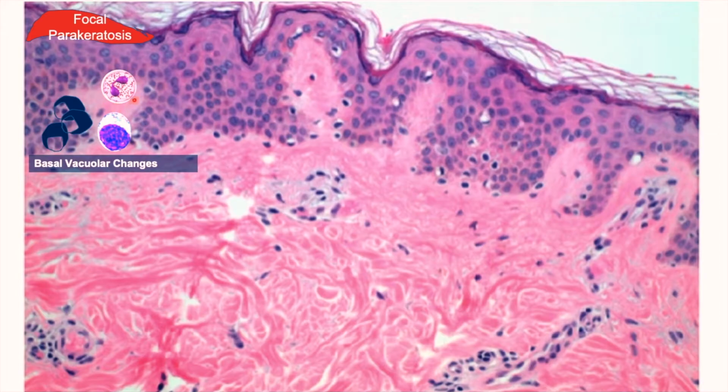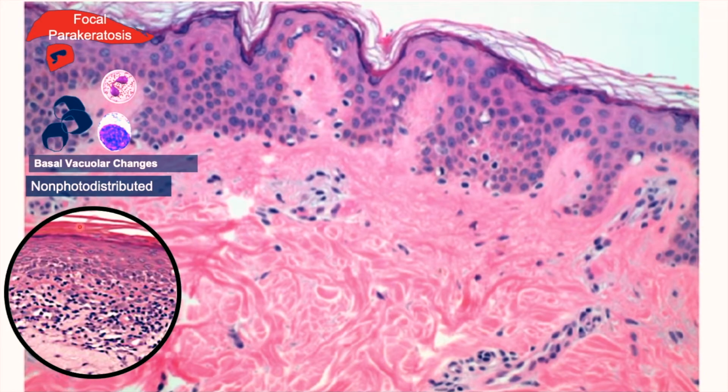We see eosinophils, which is a hallmark for medication-related dermatoses, with some plasma cells in non-photodistributed areas, and we see the dyskeratotic cells now start to appear above the basal cell layer. Like this example, this is lichenoid drug eruption, which is the mildest form of those drug-related lichenoid lesions.